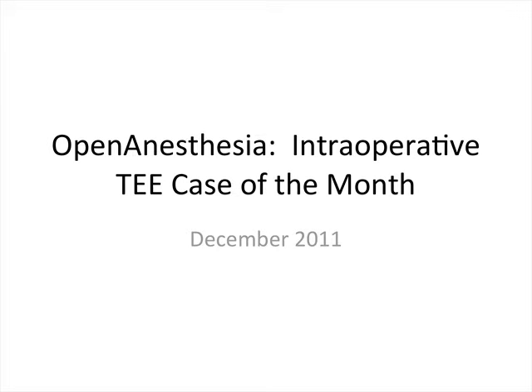This is Dr. Julie Huffmeyer with our Open Anesthesia intraoperative TEE case of the month for December 2011. Each month we feature an operative case which teaches or emphasizes an important aspect of basic intraoperative TEE.